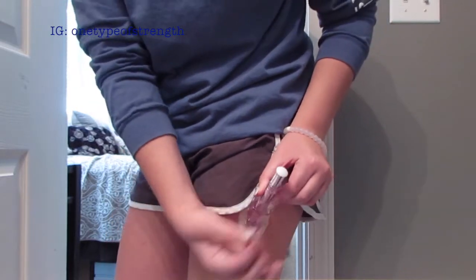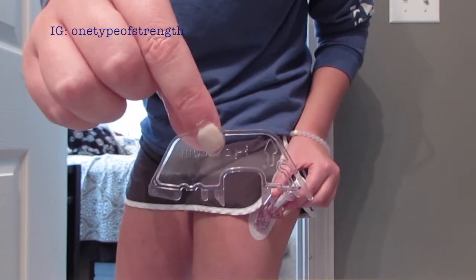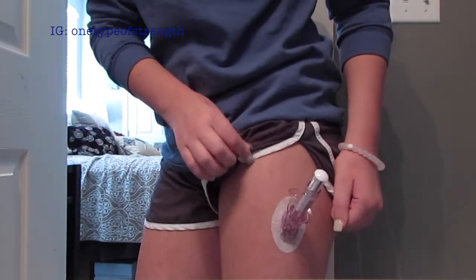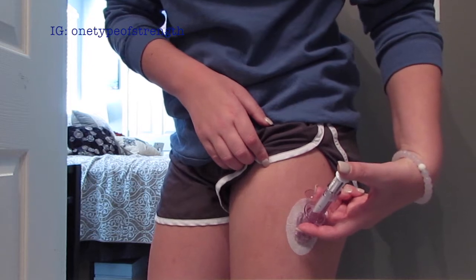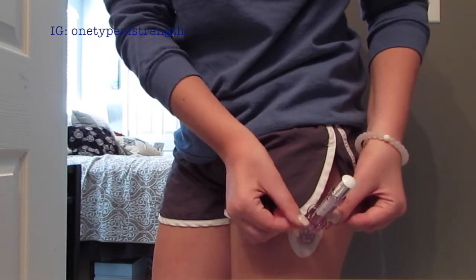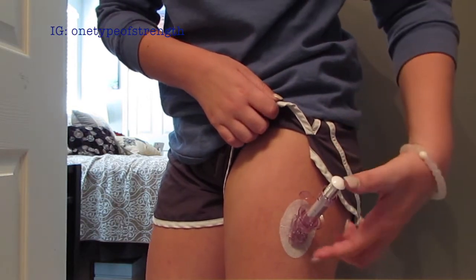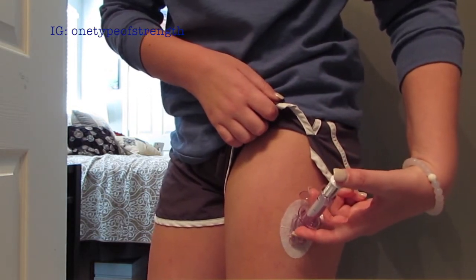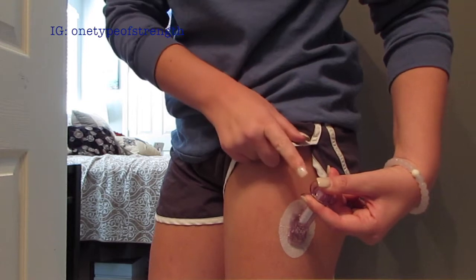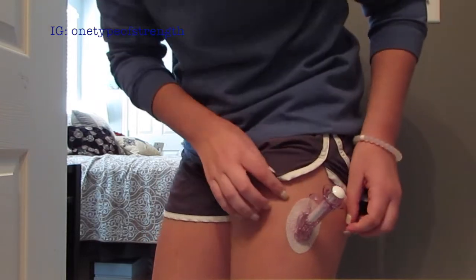The next part of the sensor change — I'm going to remove the plastic part that's in between the plunger and insert the actual sensor into my leg. I push down on the white part and then pull up on the plunger ridge part. When you push down on the white part, you will hear two clicks that insert it into the skin — one, two.